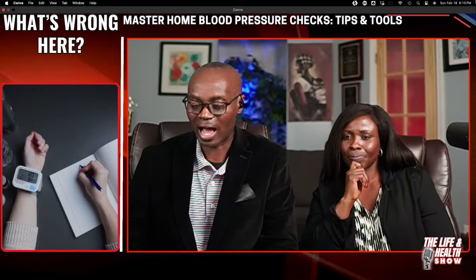So on this one, what is wrong with this? People are silent today. Nobody wants to take a stab at this, huh? All right. So what is wrong with this today? I think the person is using the wrist monitor, which doesn't really give a good reading. So that's the first one that I can see right away. Definitely, she's using the wrist monitor, which is not accurate compared to the arm cuffs. So definitely, I would not use this.